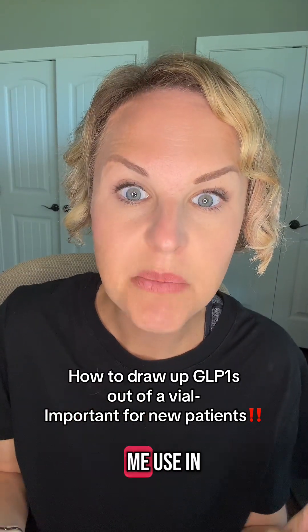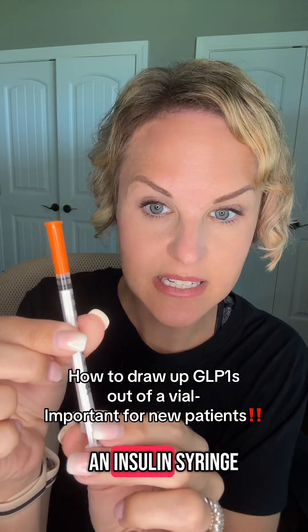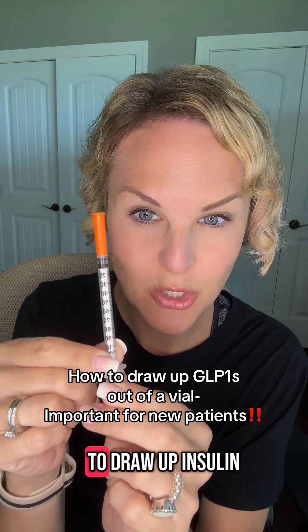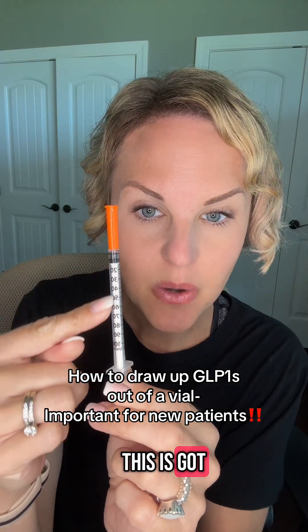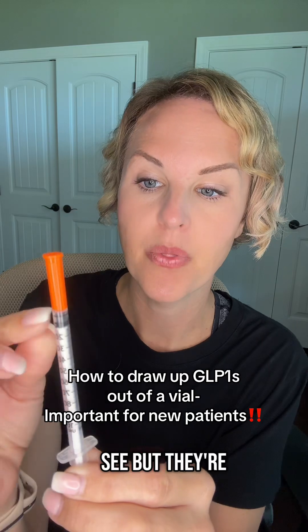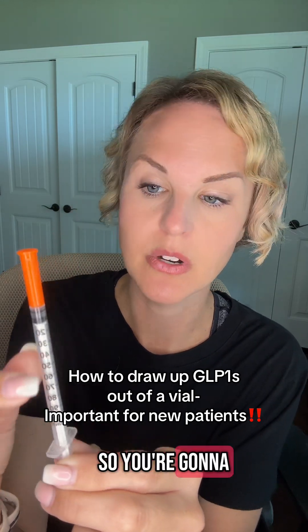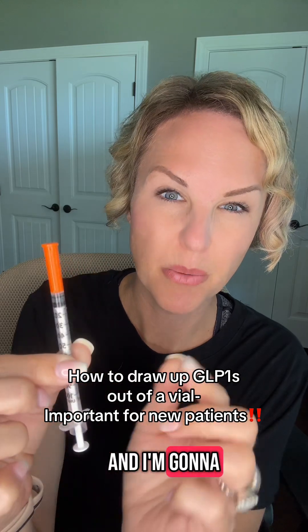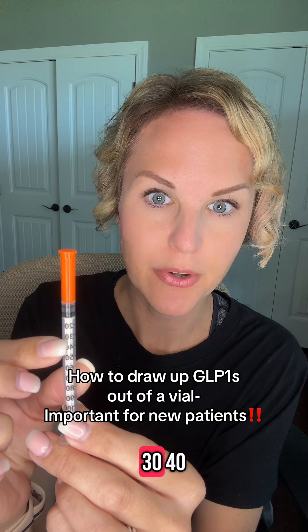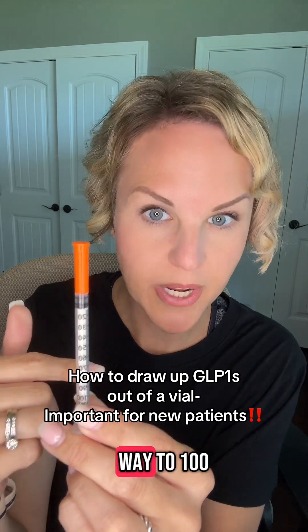The other thing you're going to see me use in this video is an insulin syringe. We call it an insulin syringe because for the most part, people use it to draw up insulin. This has got 100 marks on it, and some of the marks are really tiny and hard to see, but they're marked off in units of 10 — so you're going to see 10, 20, 30, 40, 50, 60, and so on all the way to 100.